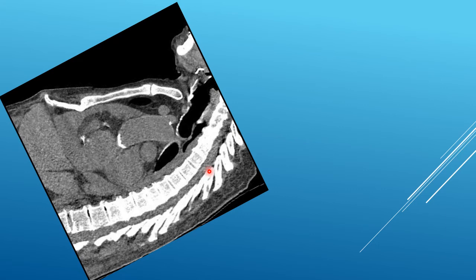This is a CT scan of a patient with a pericardial effusion around the heart with the liver and the sternum. I've put it at a slight angle to reflect the fact that patients are usually on a wedge when we do pericardiocentesis. Can you see how little separation there is between the sternum and the liver? This would be a high-risk approach for transecting the liver and would not be recommended.